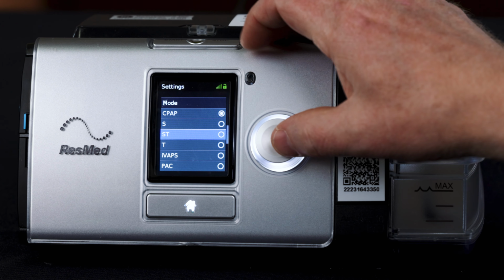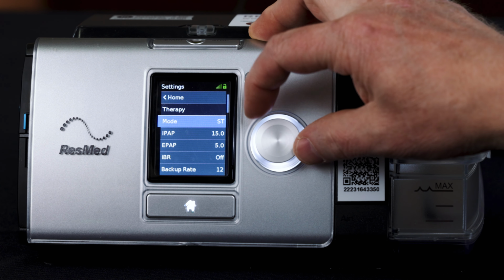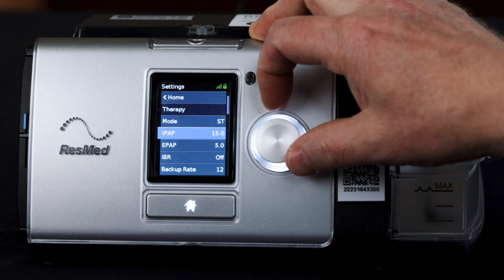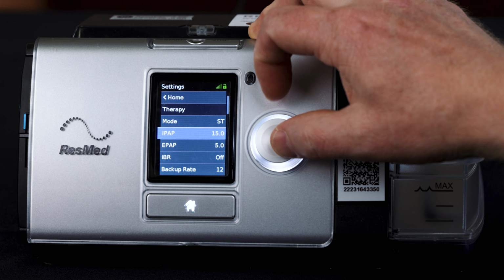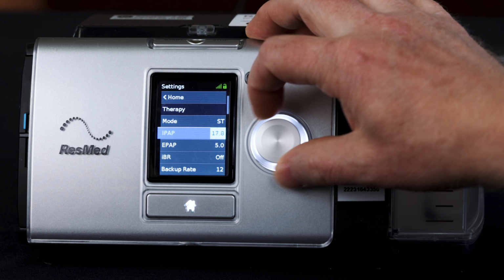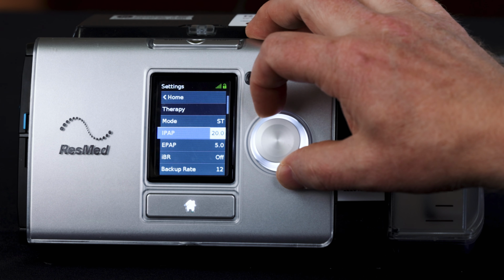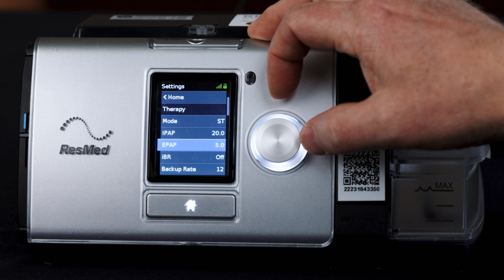The next mode I'm going to discuss is BIPAP mode. So again, based on the physician's orders, just for an example, let's do a BIPAP of 20/5. So you scroll down to IPAP, turn it all the way up to 20. Once you get to 20, then you use the confirmation knob, push it back in, and then scroll down to EPAP to adjust if needed.